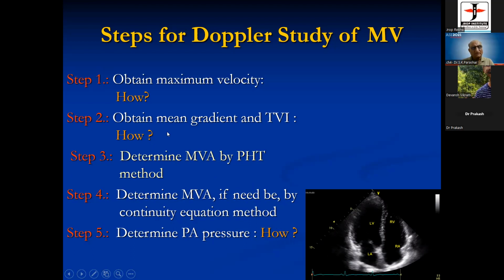So by a good apical view and a CW Doppler, you can get everything you require from a mitral valve Doppler. In a few steps, you can get everything.